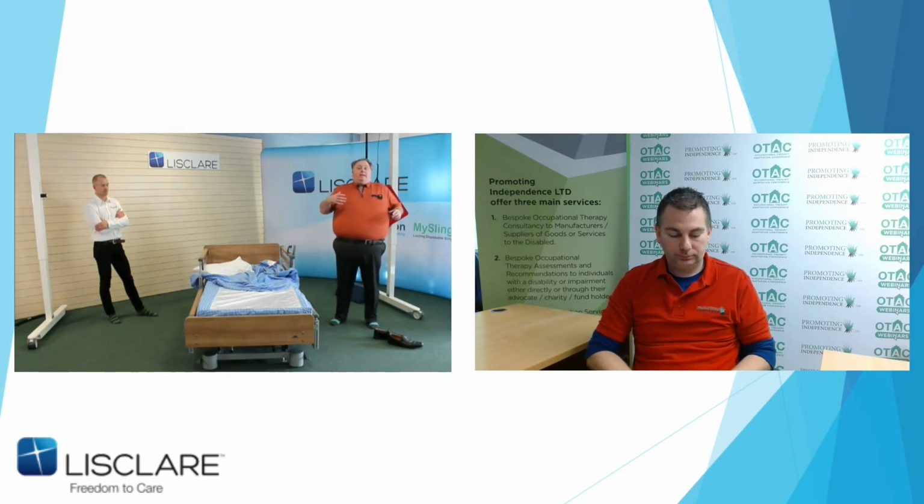If they were worried about that, I remember doing a supine lift with a patient that if her head went back at all, there was a risk of cardiac arrest, and we just placed another cushion behind her head, but we lifted her in the same similar way, and she came up in a perfect position.